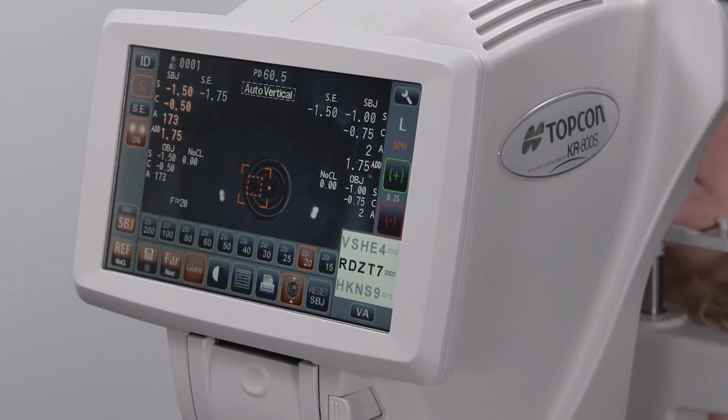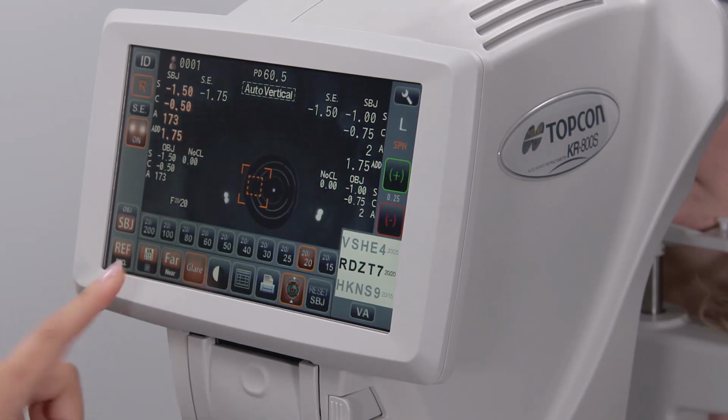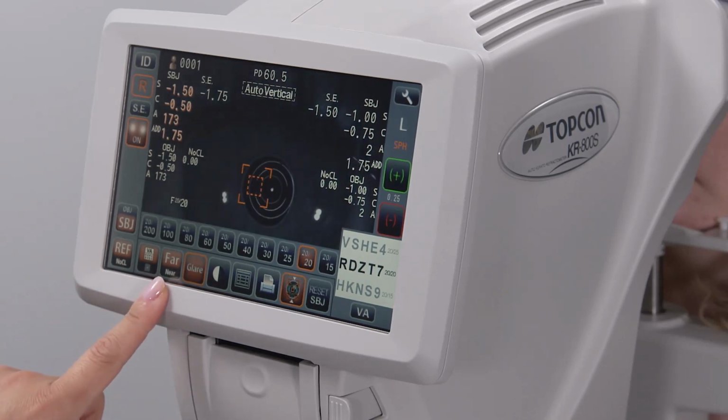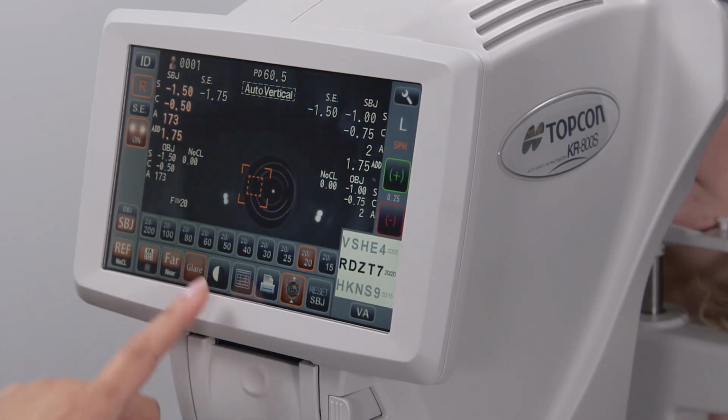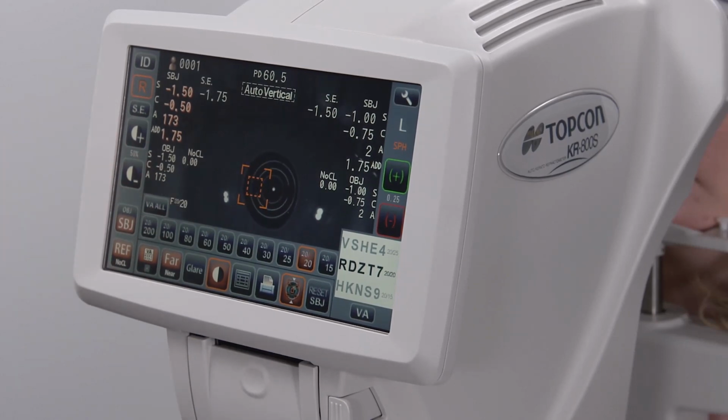To begin contrast sensitivity testing, make sure that the lower left icon is set to ref for refraction, that the next icon shows a visual acuity chart, and that the third icon is set to far. Then select the contrast icon. Use the new contrast plus and minus icons to increase or decrease the contrast to the desired value. Once these icons have been adjusted, proceed in the same way as you did with the distance vision testing.